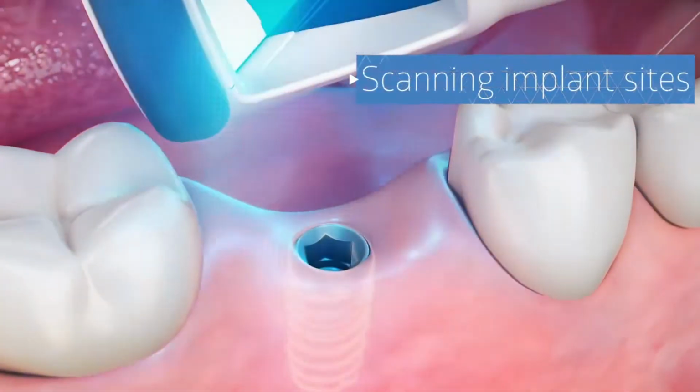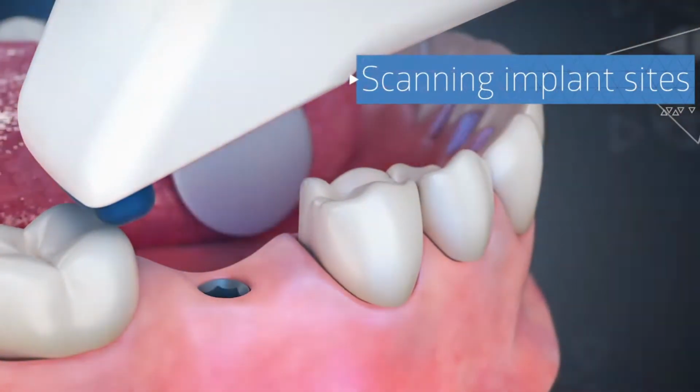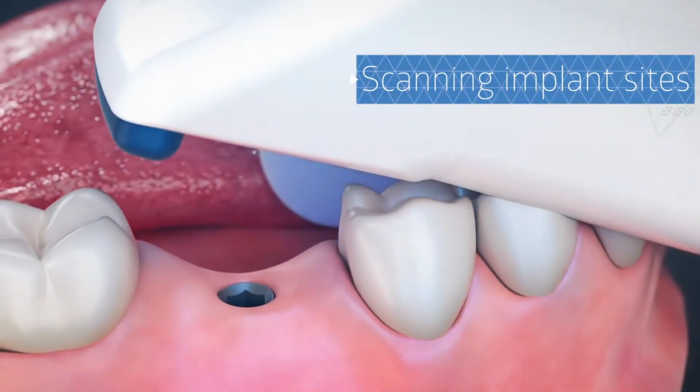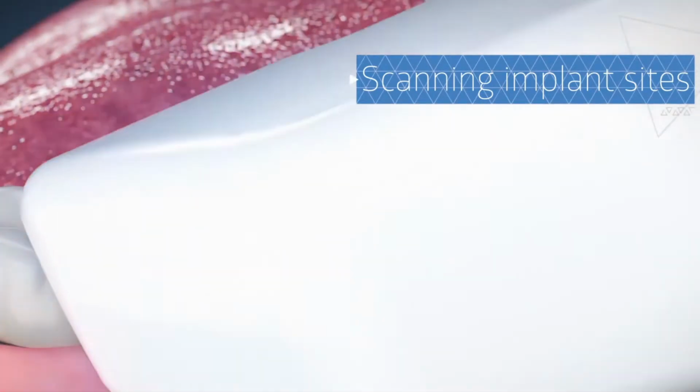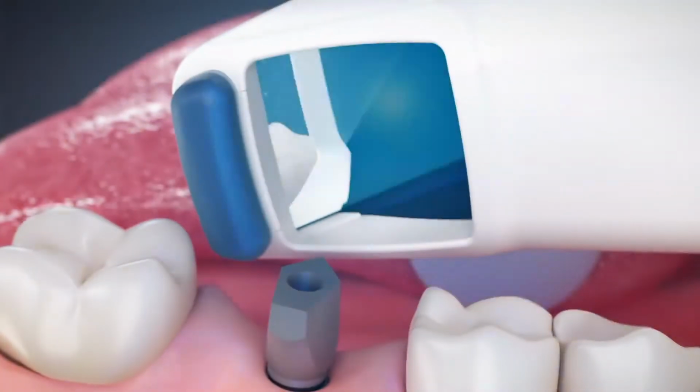When scanning implant sites, 2 scans are required. The first scan is of the tissue surrounding the implant to capture the emergence profile. Like scans of prepared teeth, it is mandatory to capture the proximal walls of the adjacent teeth as well.